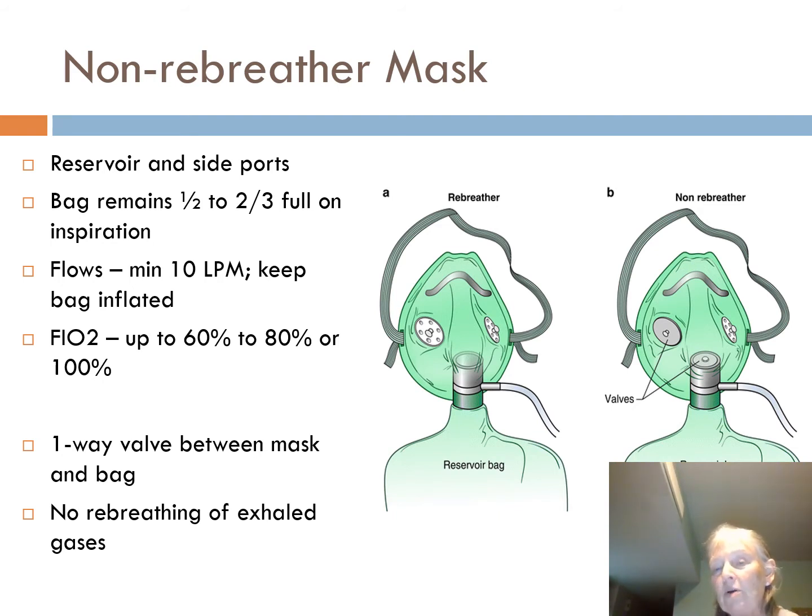out the side ports. Some of the newer ones have one valve. Some of them have two. Well, you're not going to see that many. And then some of these really don't have any at this particular point in time, okay? Part of the reason is that patients have become disconnected from their flow meters, and because of the high buildup of the CO2, they have actually died as a result of it.